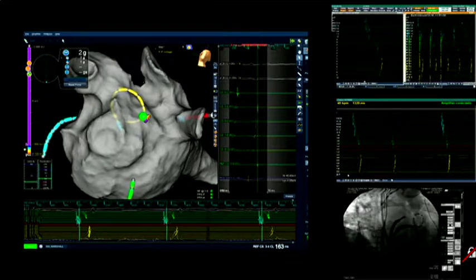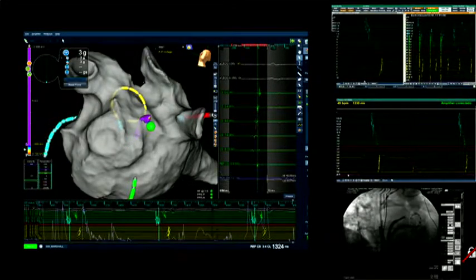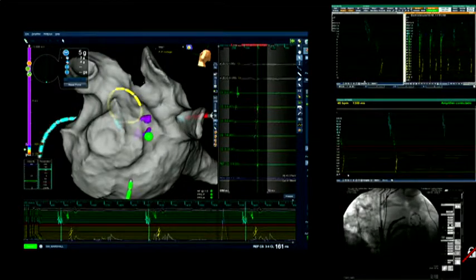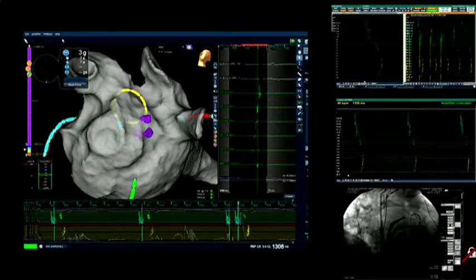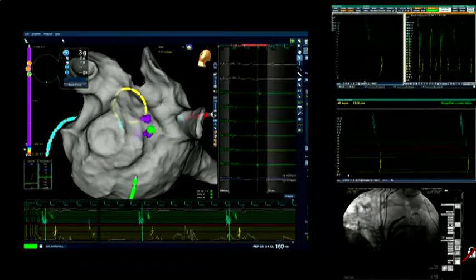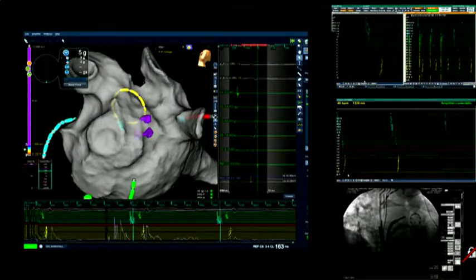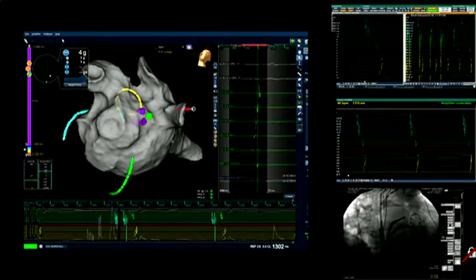I am going to come to a more proximal position, but I don't want to lose the cannulation of the Marshall vein. It was not difficult, but we don't want to repeat the cannulation of Marshall's vein. No, I prefer not to do that again. Well, when I go too proximal, we lose the NAVIX. Let me move up again.